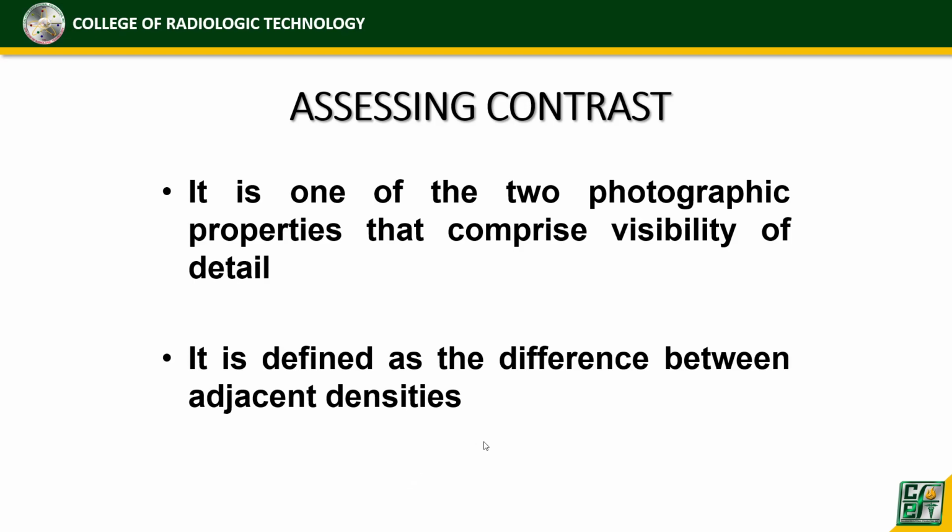Sorry, nakamute nga. So, as I was saying, radiographic contrast is one of the two photographic properties when it comes to radiographic image quality. And contrast is important in order for us to see the image. Or basically, it deals with the visibility of detail of the image in the radiograph.